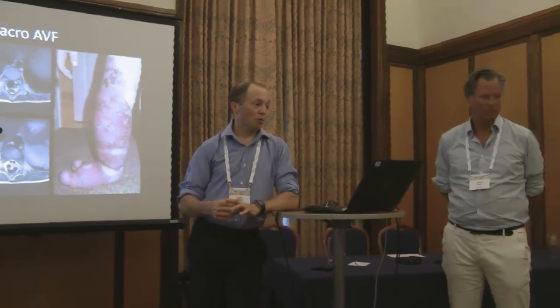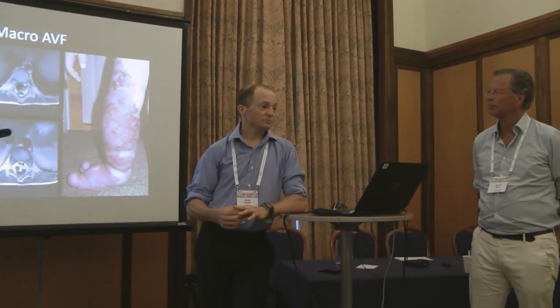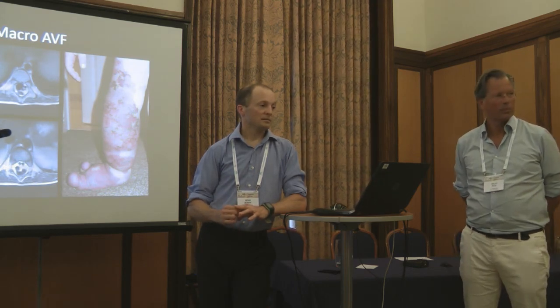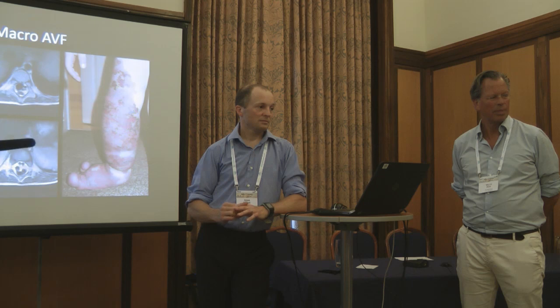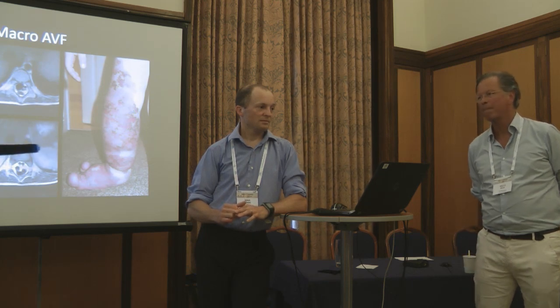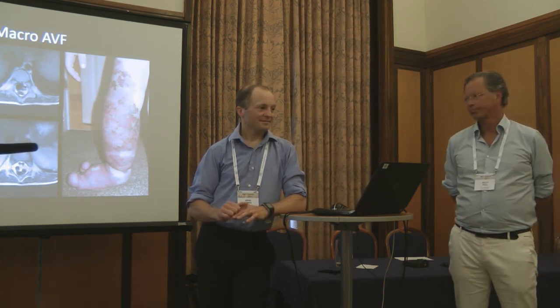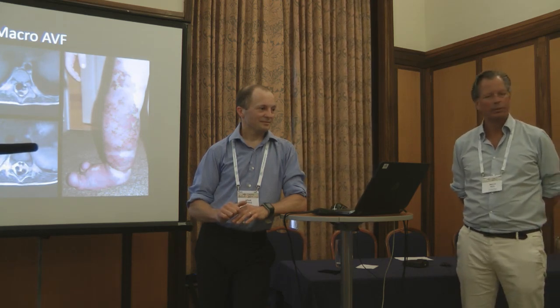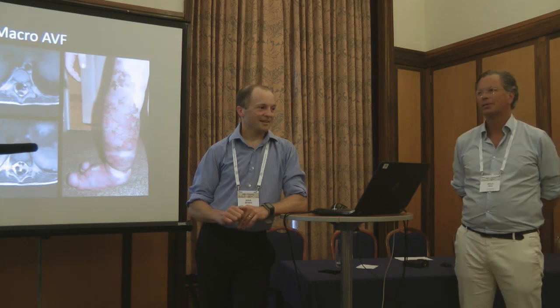Yeah, or even localizing, which you showed a nice example of with the XA. With surgery you can really easily see, for example. Yeah. Or to combine it also for, of course, we're at first only thinking of using balloons for complex aneurysms in the brain, but also for spine. It will not be often. It's also through integration. You see that your radiologist colleagues do this quite often with the vascular surgeons. Yes. I think for neurosurgeons also it's quite an added value.